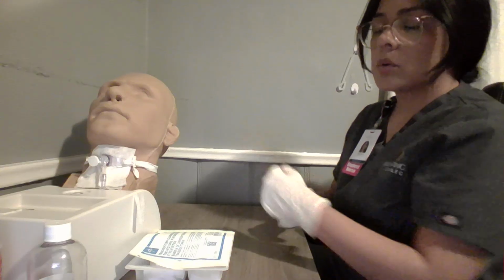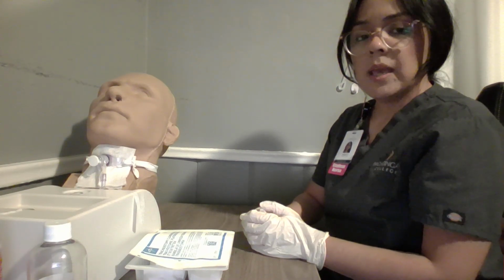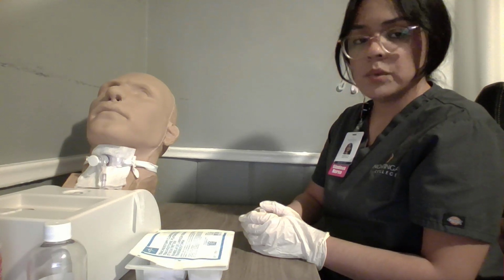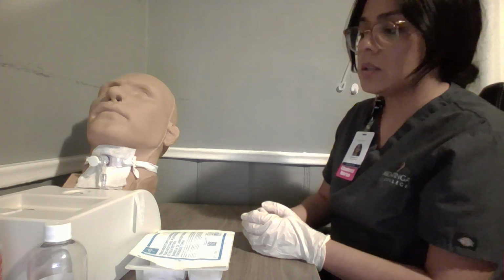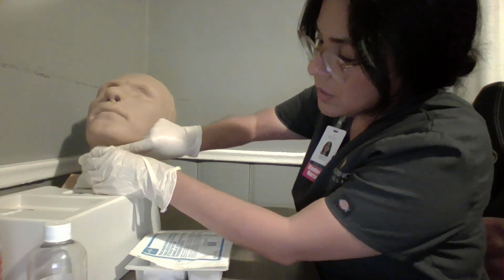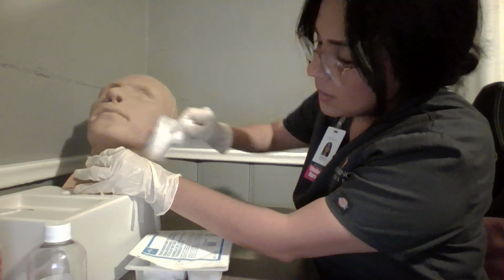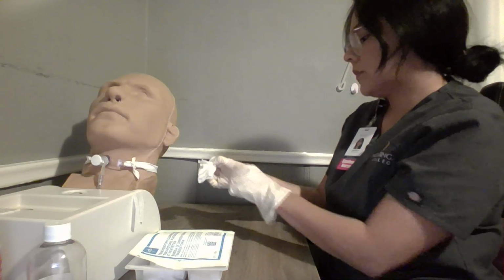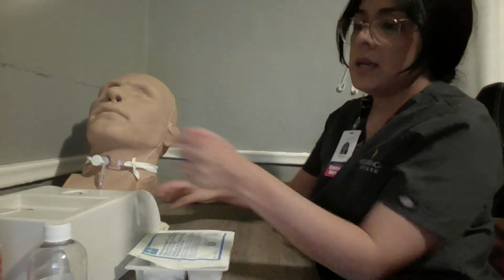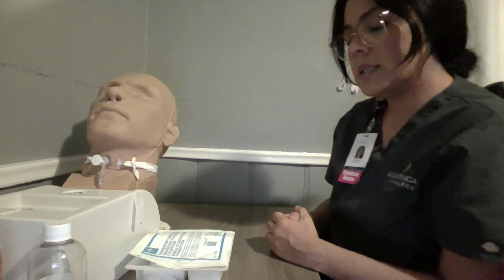In a real world setting, I would ask a nurse or an NAP to help me with the procedure, and I would ask them to stabilize the trach so it doesn't dislodge or move. I will remove the oxygen source, and I will then remove the soiled tracheostomy dressing. I will remove and discard my gloves along with the dressing. I will perform hand hygiene. And now I will organize my supplies.